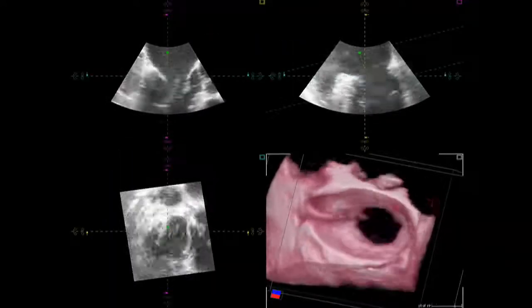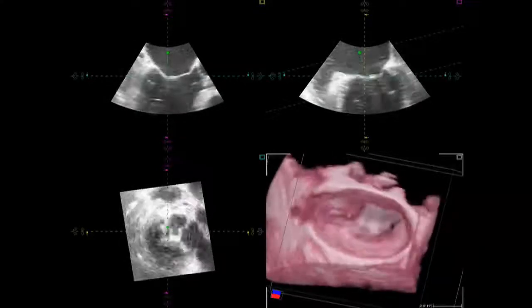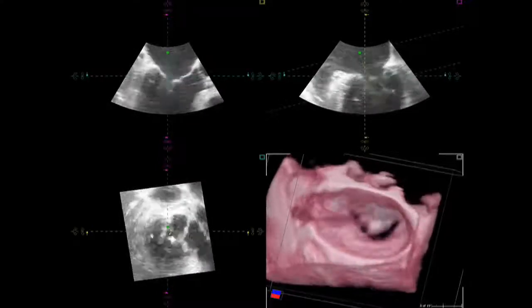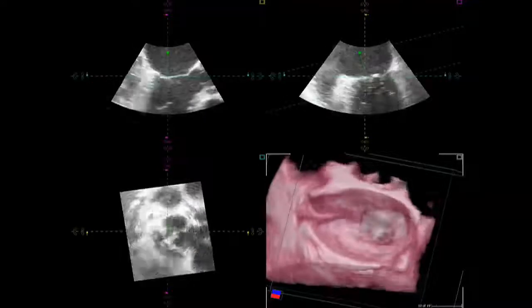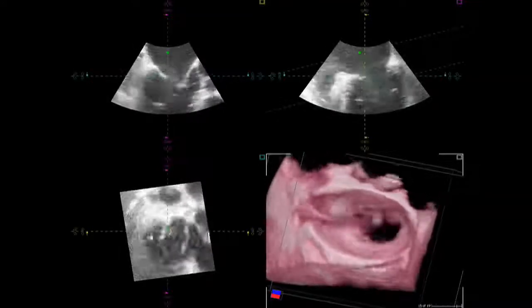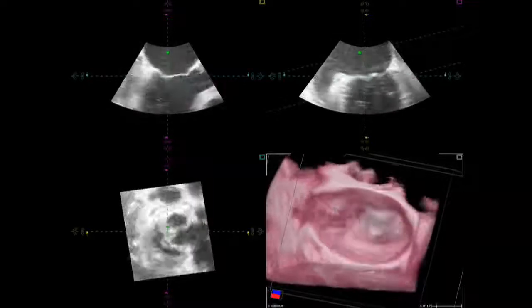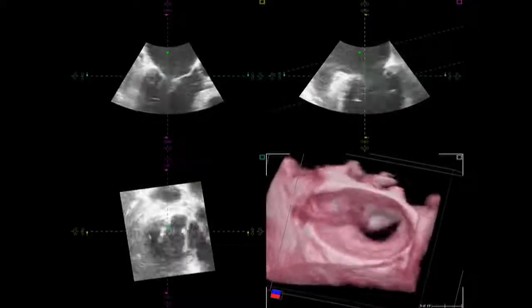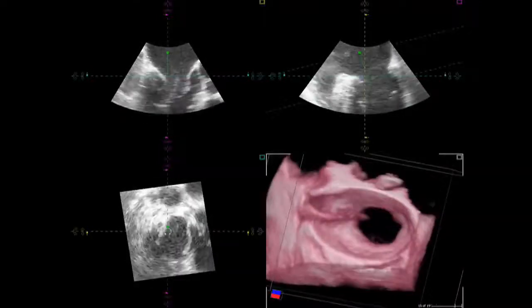Three-dimensional echocardiography with transesophageal probe allows us to look deeper into the patient, into the heart structures. In this view, in the right lower corner with the flesh tone color, one can see a tunnel. This is the left atrial appendage. And in the 9 o'clock portion of this, you can see a string or a stream of blood flow. We would never see this in our conventional echocardiography.